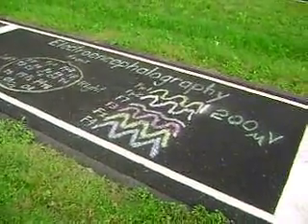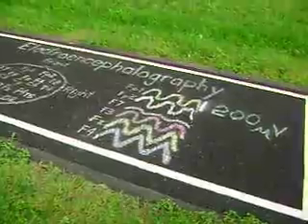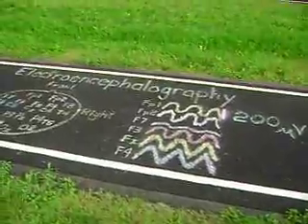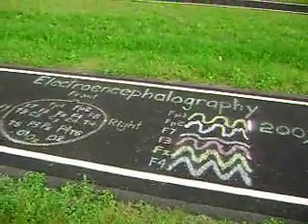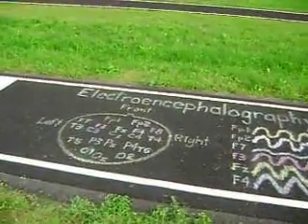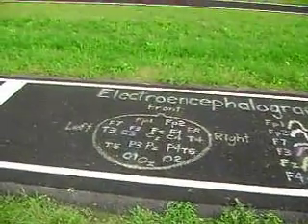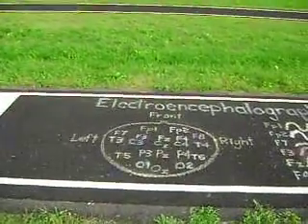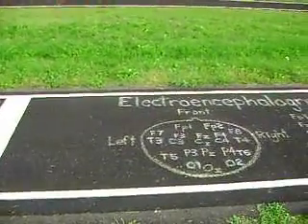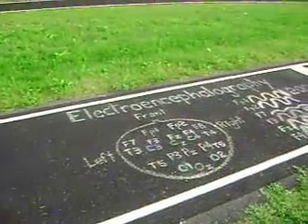Focal brain lesions. The presence of continuous focal polymorphic delta activity, especially in combination with depression of ipsilateral background rhythms, strongly suggests a focal lesion. However, an area of focal dysfunction, as may be seen after complicated migraine or a focal seizure, should also be considered. Periodic lateralized epileptiform discharges, PLEDs, are frequently associated with irritative lesions such as acute cerebral infarcts or herpes simplex encephalitis.